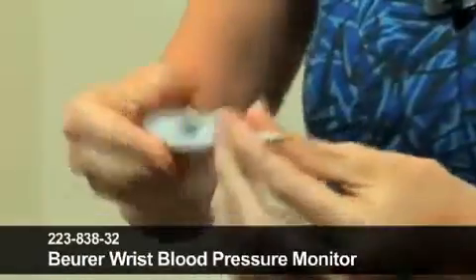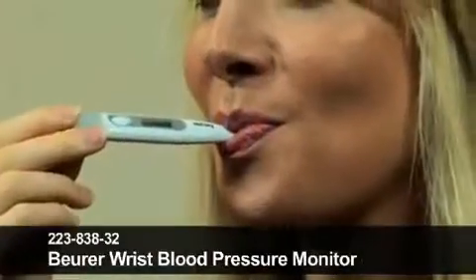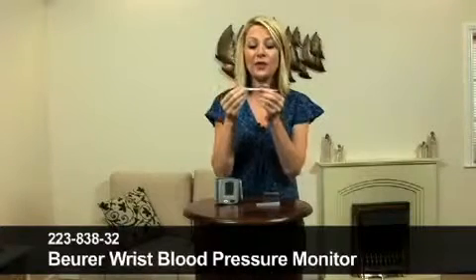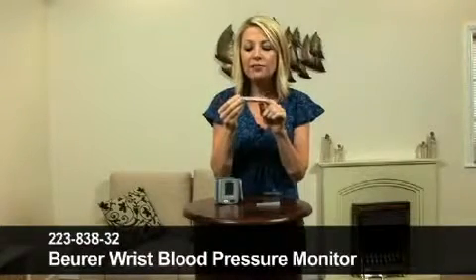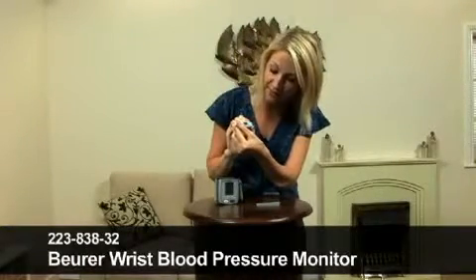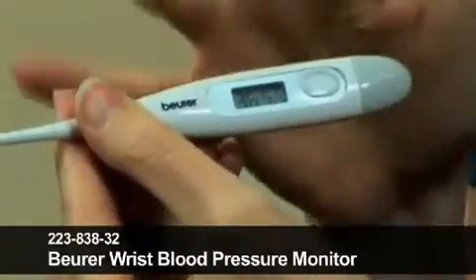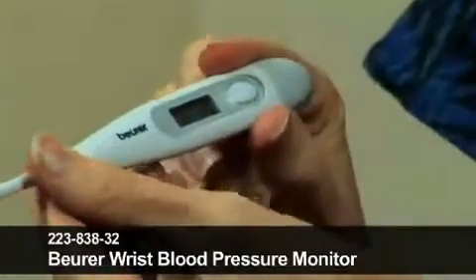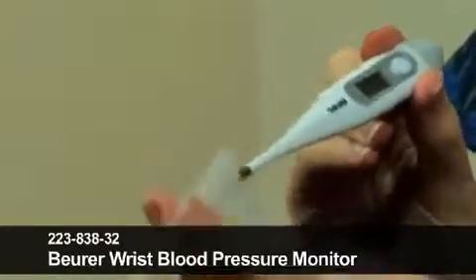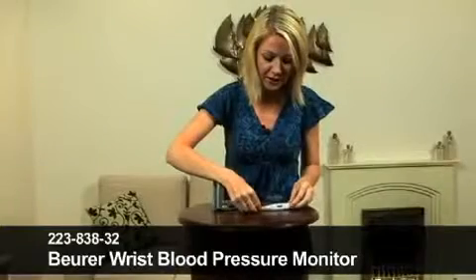So, switch it on, pop it into the mouth. You will hear that the beep comes up, and that indicates that it's taking the temperature. 36.5 is my temperature at the moment, which I think is perfectly acceptable. I think 37.5 is about the norm. Very, very simple to use. Easy to wipe clean as well, and then it can be popped back into the plastic cover and stored away until you need to use it again.